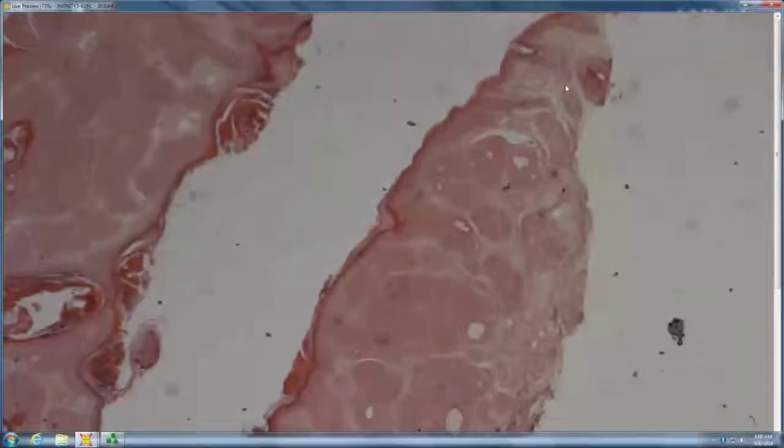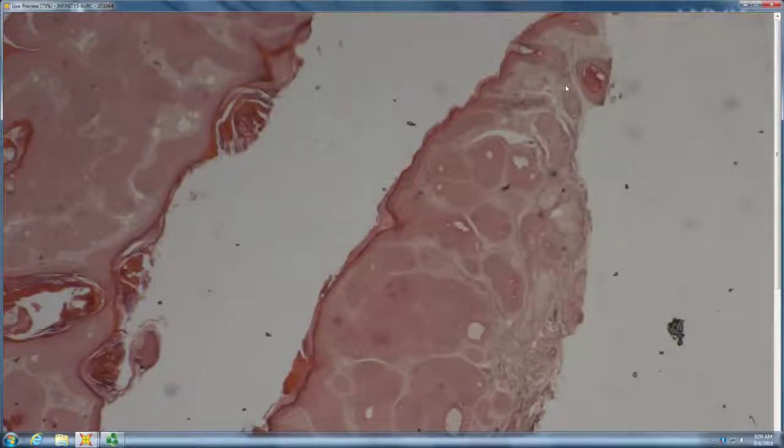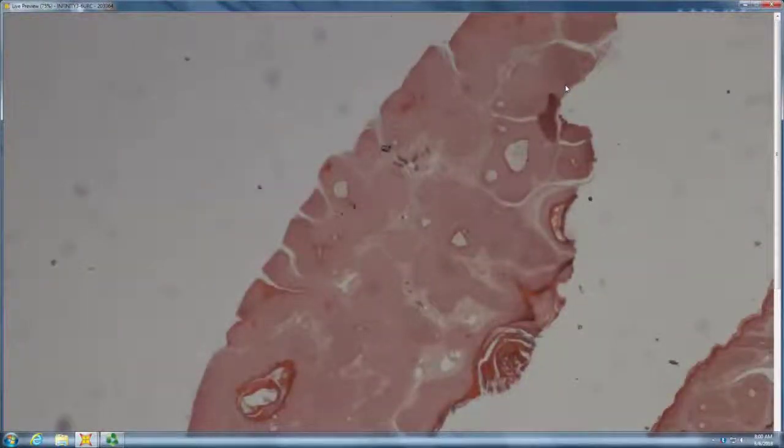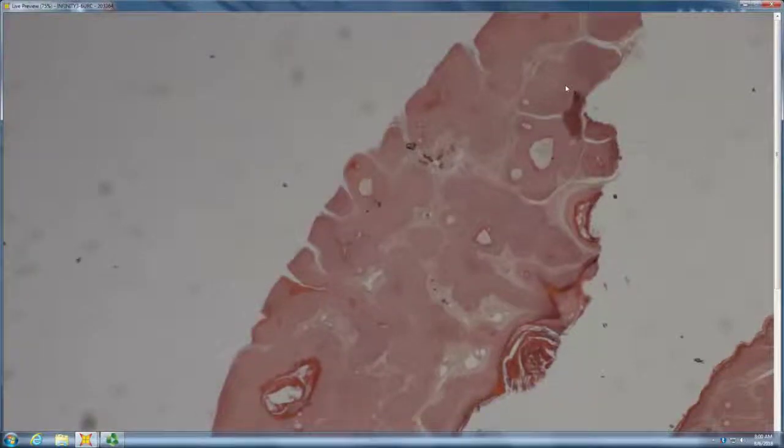Oh, me. So it's hard to recognize. I can see the follicular and the finger connected to the follicle. But it's several follicular like this, and so if it's just one follicle, I think it may be the pilar sheath acanthoma. Very well done.